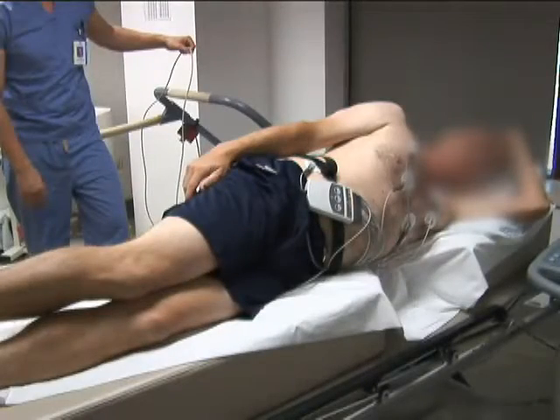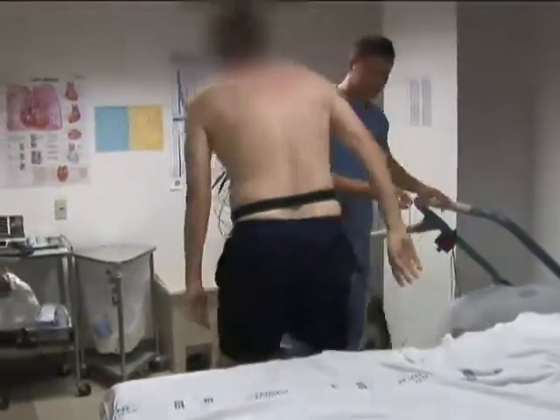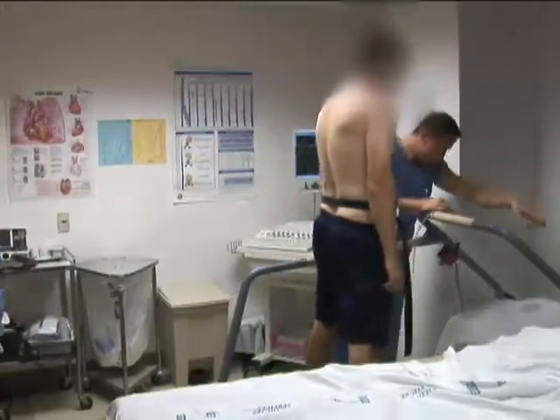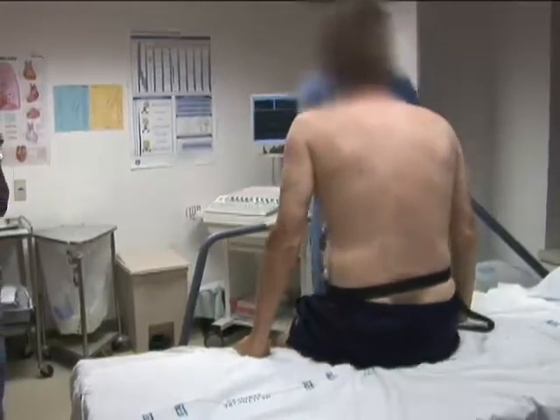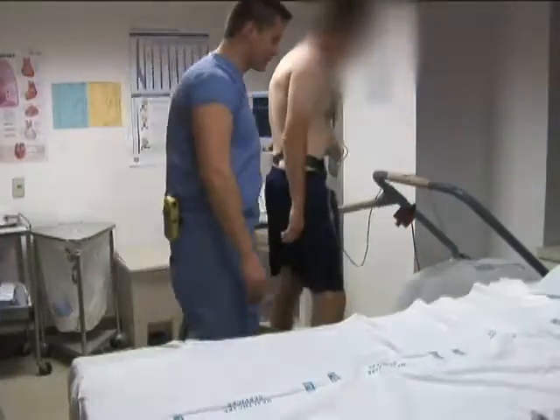The ECG acquisition module is secured around the patient so that it does not become dislodged during treadmill use. It is critical that the post-exercise echo images be recorded as soon as treadmill exercise is discontinued. Myocardial ischemia may resolve if the delay between discontinuation of exercise and post-stress image acquisition is lengthy. Patients are counseled on the need for rapid transfer. Before treadmill exercise begins, the patient should perform a trial run of moving from the treadmill to the imaging bed to ensure that attached cords do not hinder transfer and to optimize patient positioning.